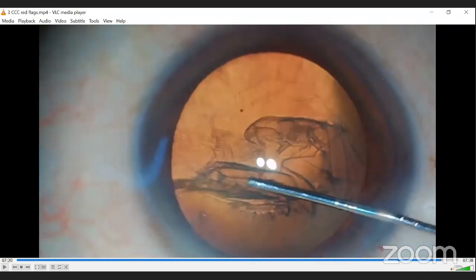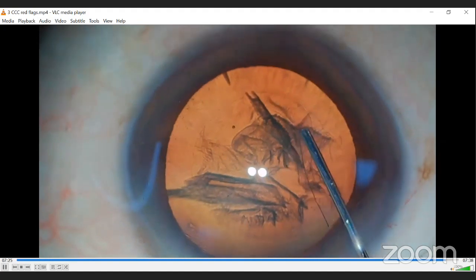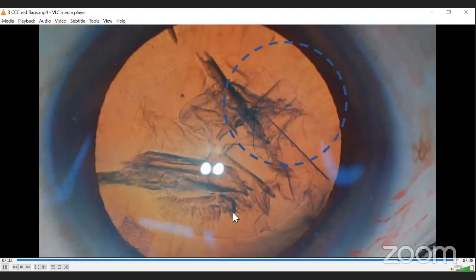Can anybody tell me what was the mistake that was done? Anyone? Yes. Very important. The rhexis is not complete. He didn't remove the flap. He thought that the rhexis was complete, but watch here. The flap is still there and the rhexis is incomplete. Luckily for him, it didn't extend out, but I think it is better to be cautious and remove the flap to confirm that the rhexis is complete.